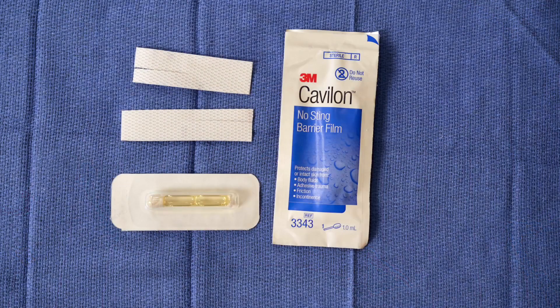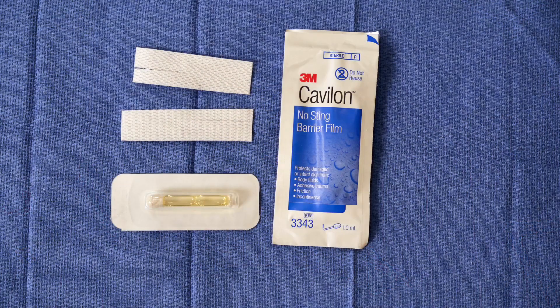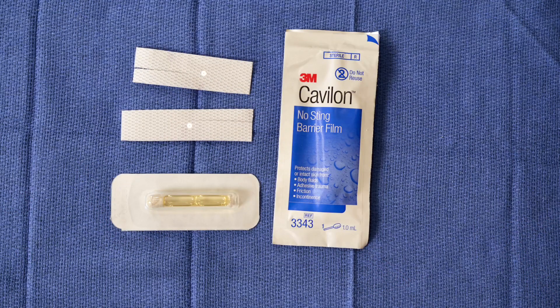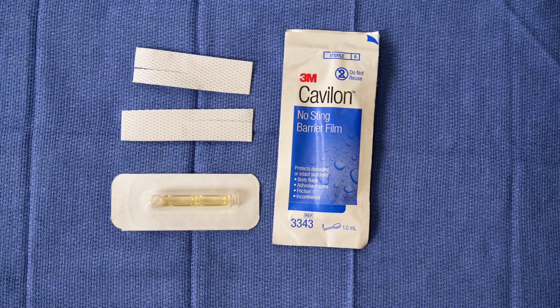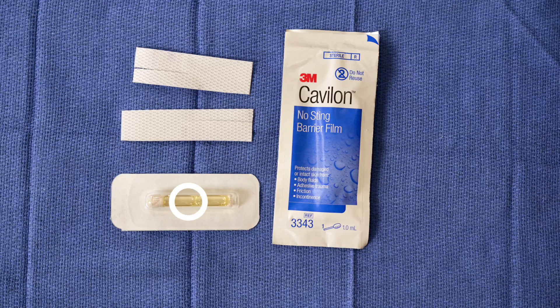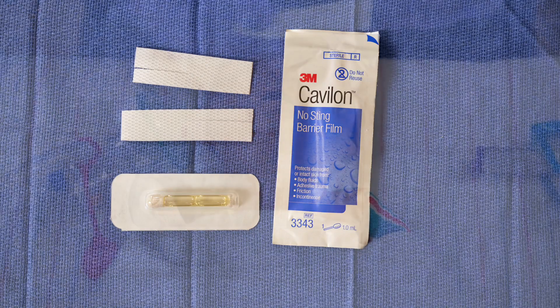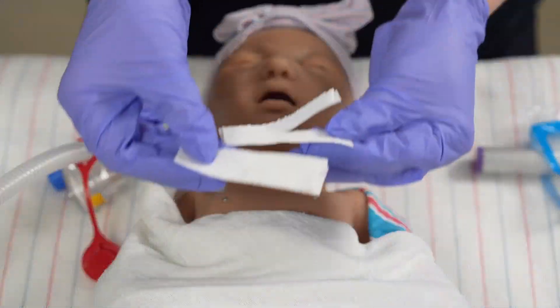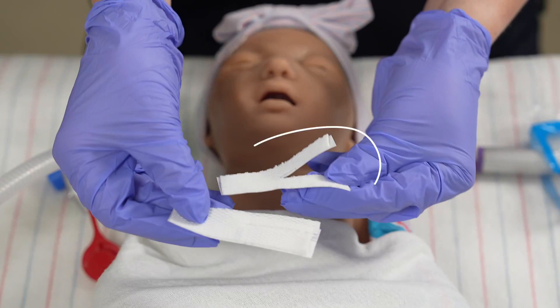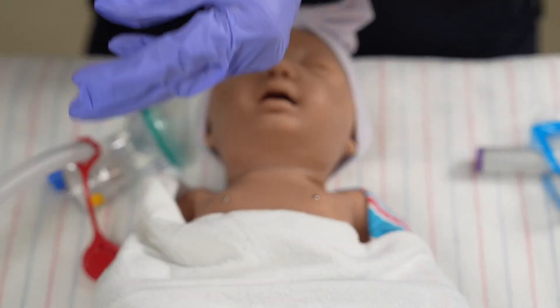Gather the necessary supplies to secure the tube, including tape, a polymer film for skin protectant, and an adhesive product. Cut two strips of tape into a Y shape and set aside.